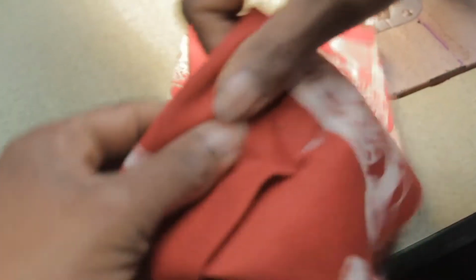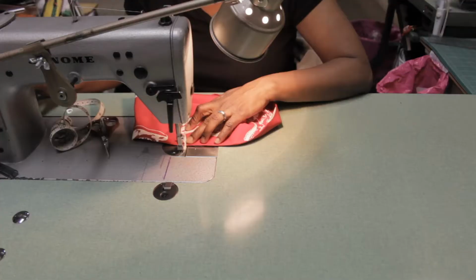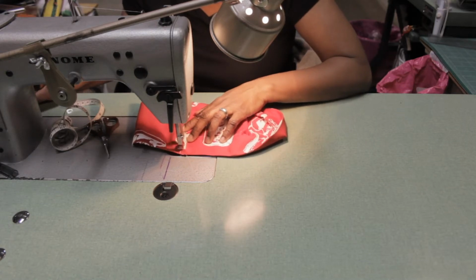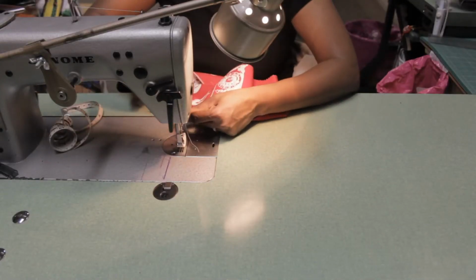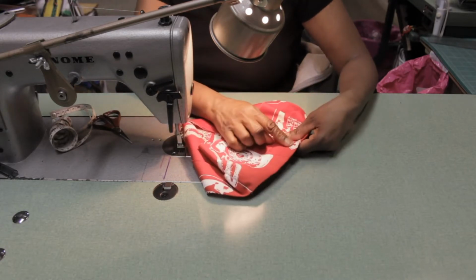So I want to make sure that I can catch the elastic when I'm sewing. So the elastic is in there, and I'm going to do again just a simple stitch, and you're going to be again what you call back tacking a few times along that seam. So now we have caught the elastic in there. The pin is still in here.